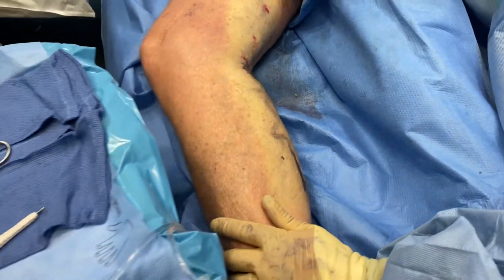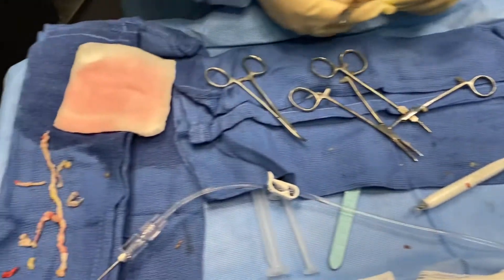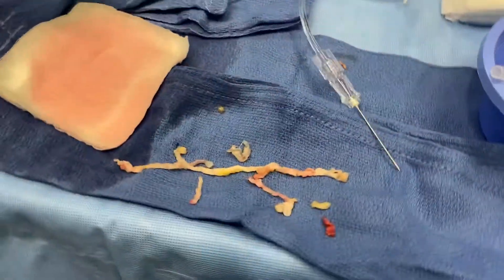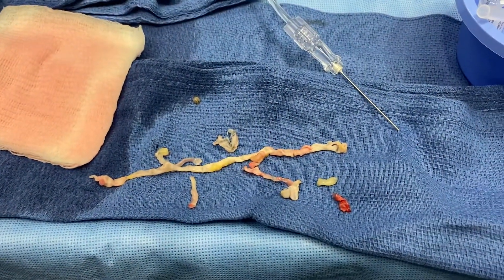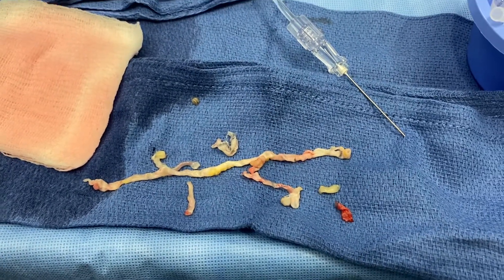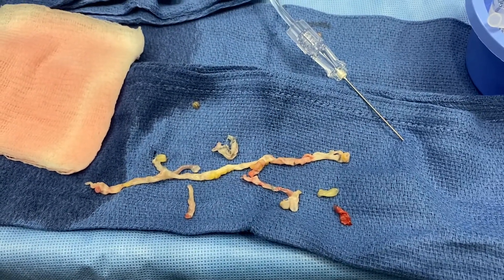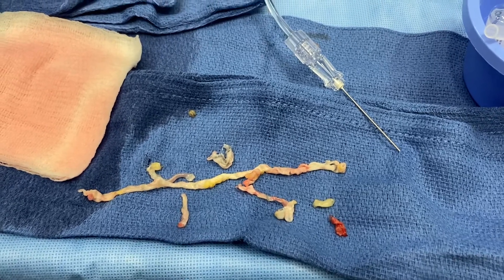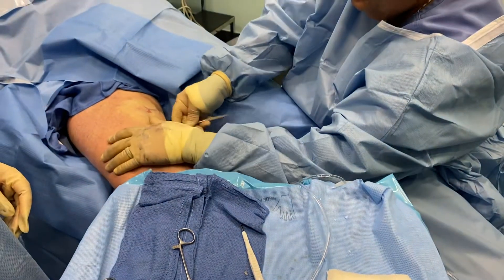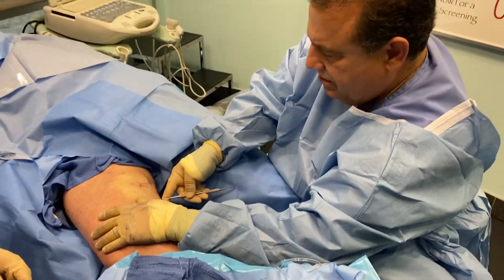The vein pieces are over here on the tray. This is the vein that was in the patient's leg — you can see how long it is. All these vein segments are gone, so the patient will see basically instant results. The procedure is called a minimal phlebectomy, performed by Dr. Bonavita.